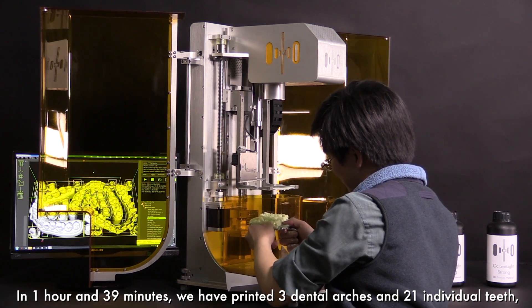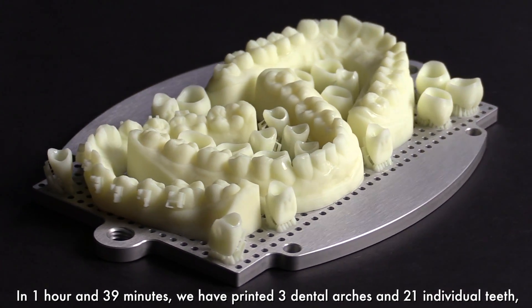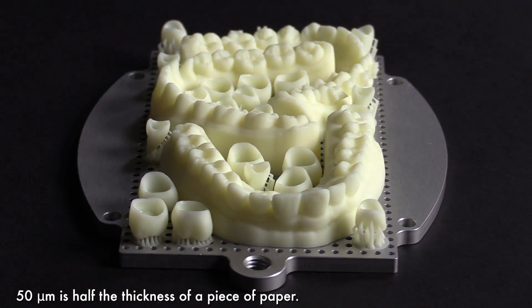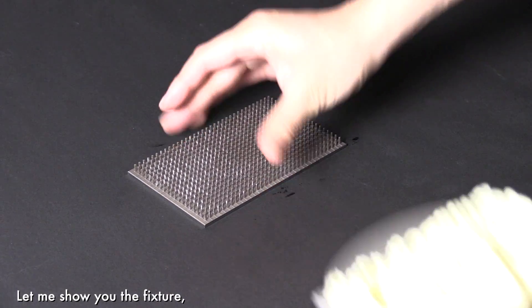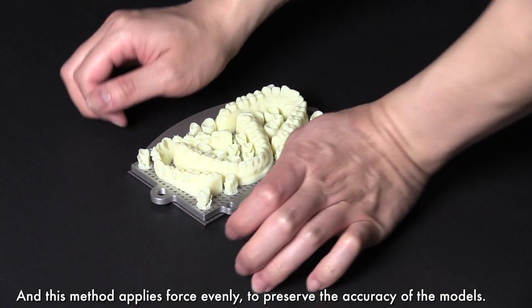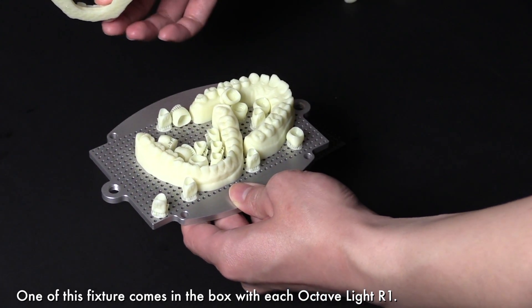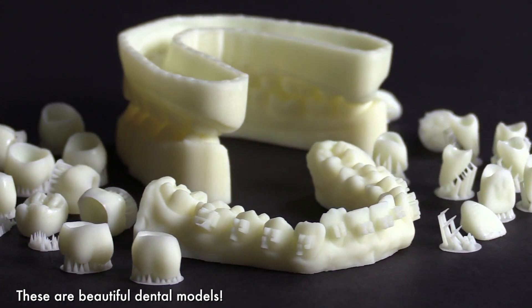In 1 hour and 39 minutes, we have printed 3 dental arches and 21 individual teeth at 50 micrometer layer height. 50 micrometers is half the thickness of a piece of paper. Everything is precise and smooth as you can clearly see. Let me show you the fixture for conveniently removing the 3D printed models from the build plate. This method applies force evenly to preserve the accuracy of the models. One of these fixtures comes in the box with each Octave Lights R1. These are beautiful dental models.